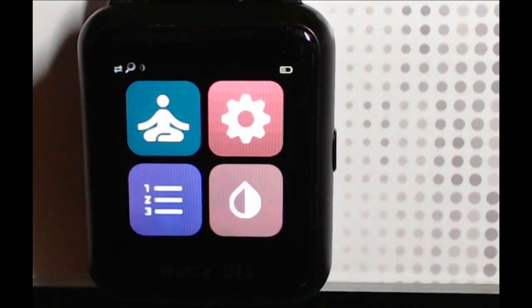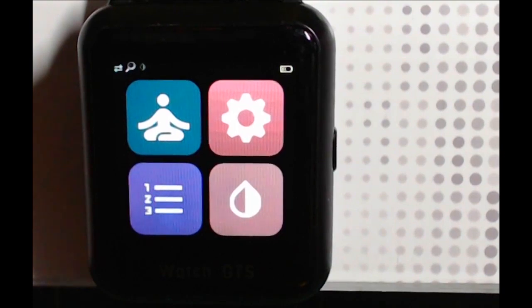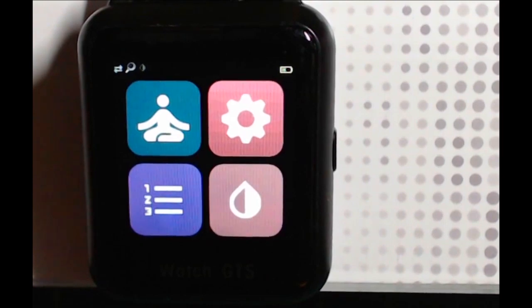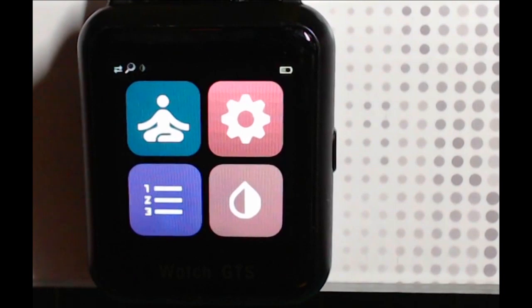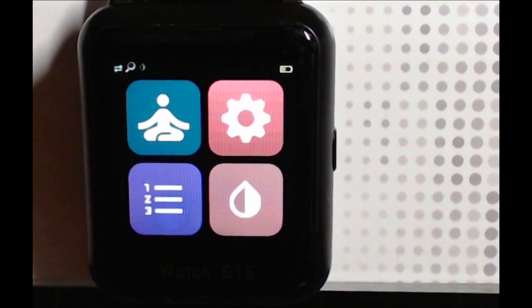Here I'm going to demonstrate how to set the transmitter ID on the BlueJay GTS. First, bring up the menu screen, which you can bring up by either double tapping the side button or swiping down from the top. From the menu screen, select the X-Drip Core icon on the bottom right.